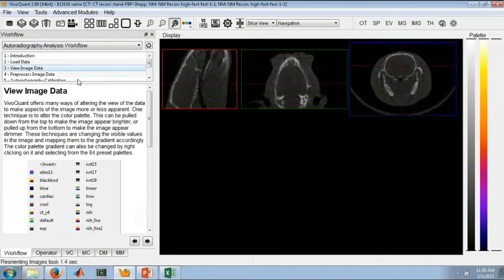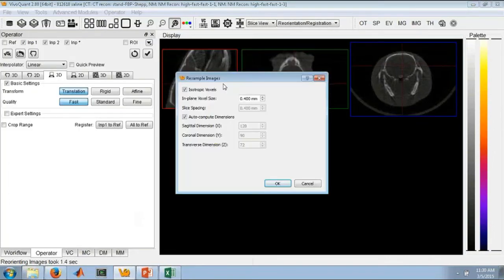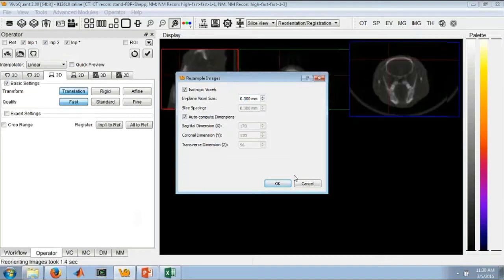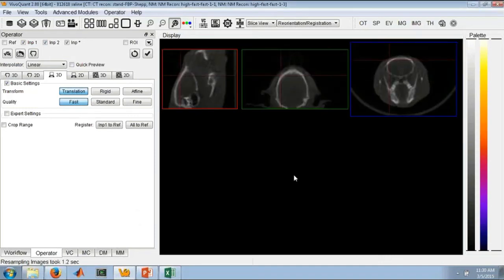The resampling hasn't changed. We still simply select Tools, Resample Data, and can change. For instance, we want to upsample this to 0.3 millimeter voxels. We can do that very simply.